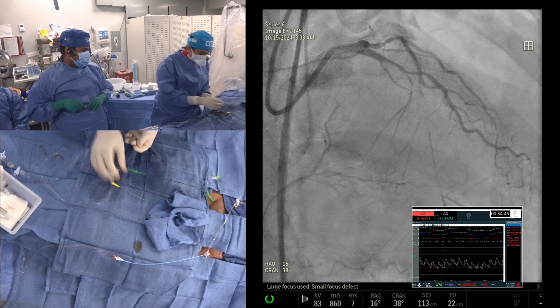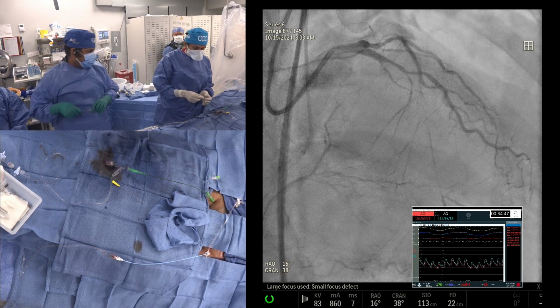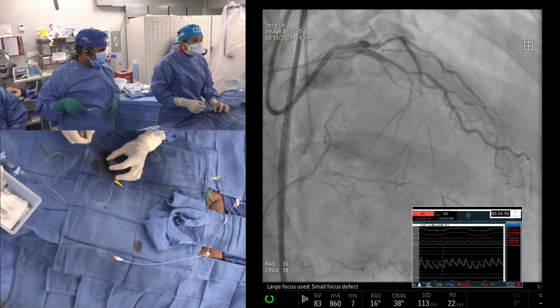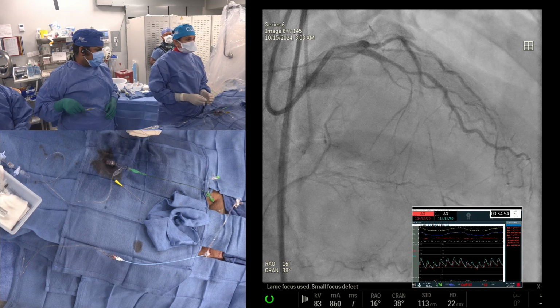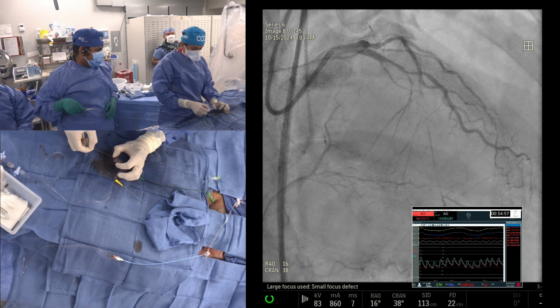Too many steps. Okay, so let's go to the presentation while we are getting your first wire. You're doing a fine cross and Fielder wire, and you go to there, and what wire will you be using after that? First wire.